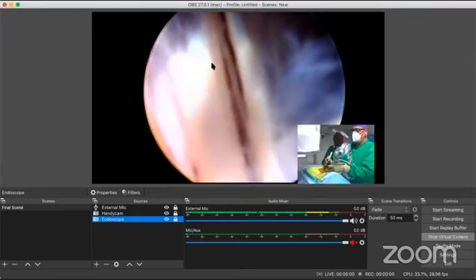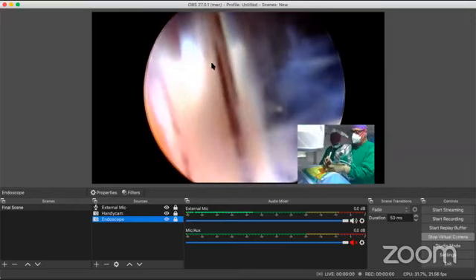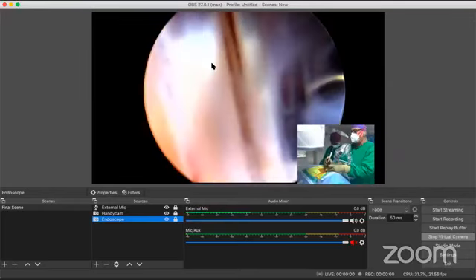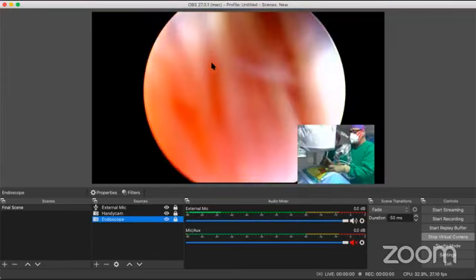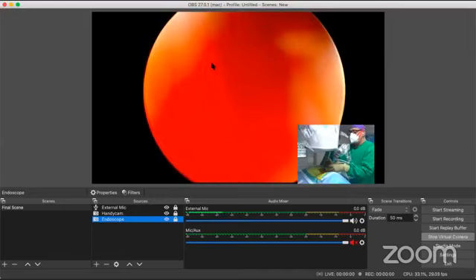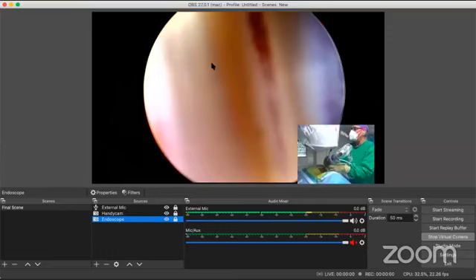Take the machine up, please. Bring the C-arm in front, please. Thank you. One shoot, please. See, now my probe is on the lower lamina.